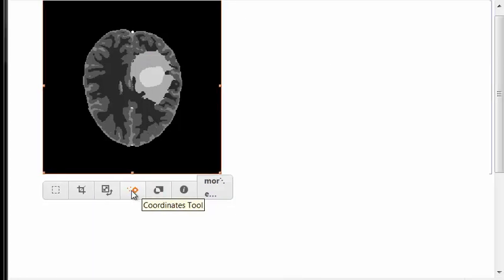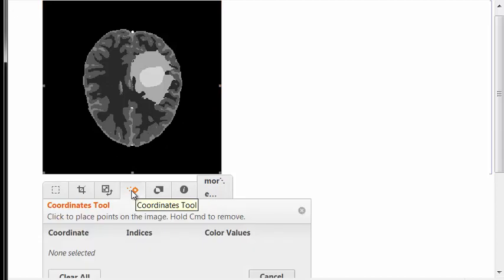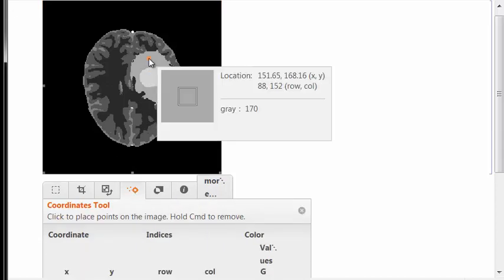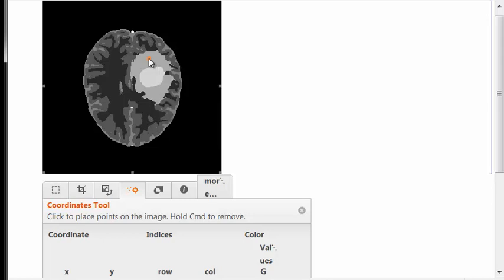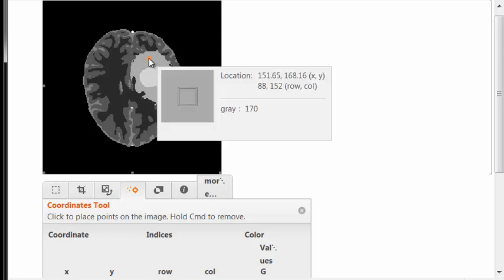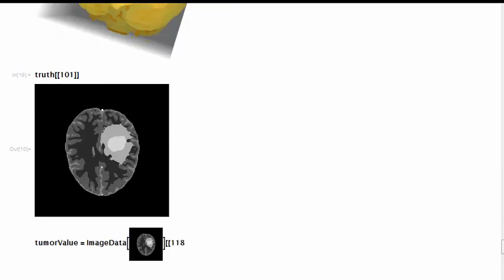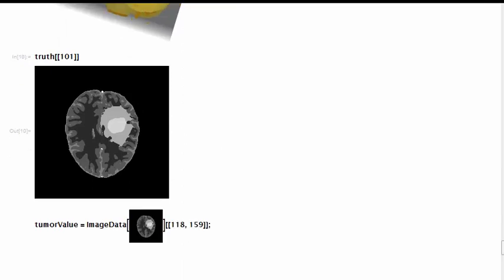And a curious thing is that here we see gray levels as integers. But we're not going to use it directly in order to highlight a difference in representation between what you see here as the value of the gray level using the coordinates tool and what is seen when one calls image data on the same XY coordinates.